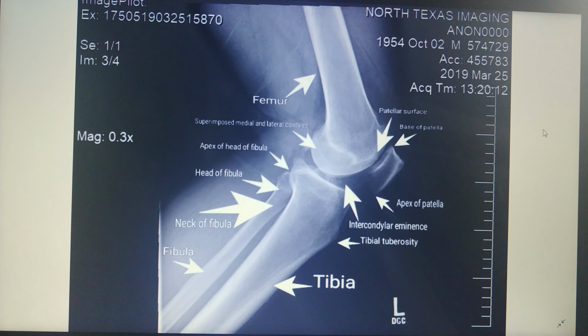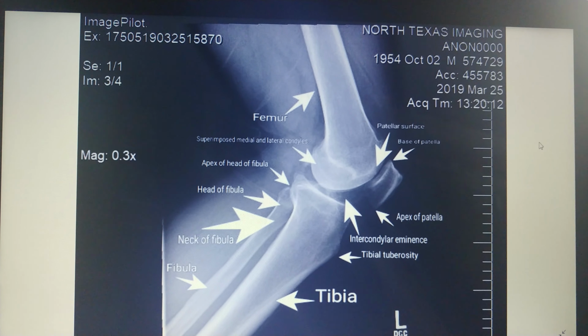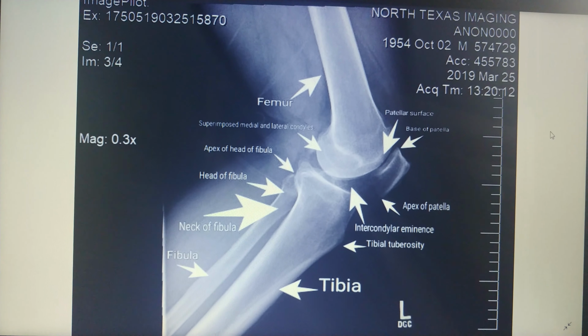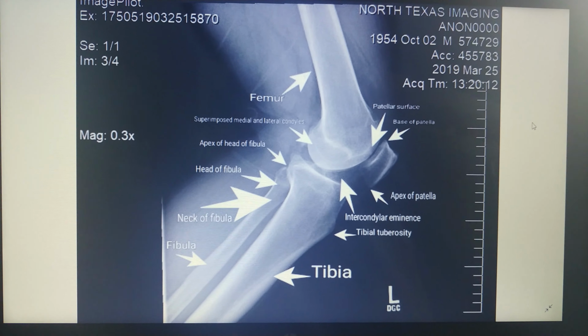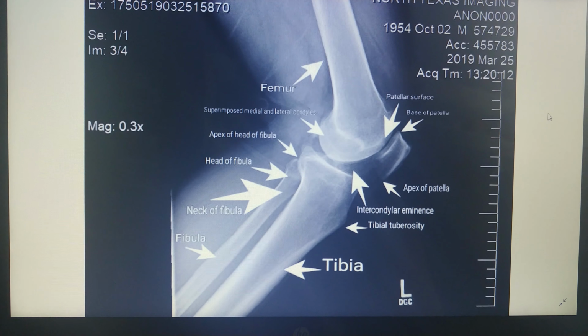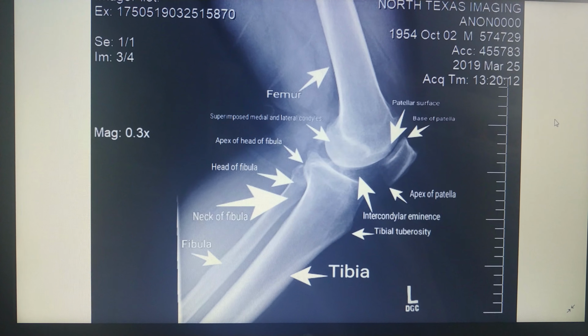Once I do that, I go to the waiting room, pick up our patient, bring him in, and ask him his name and birthday. He gives me both, and I see that it matches what we have on the requisition form. Then I confirm with him that we're doing standing bilateral knees, and he agrees. And so we get ready to get started.